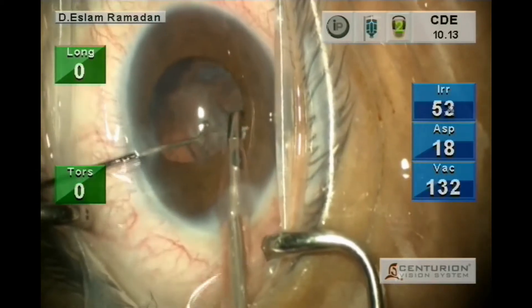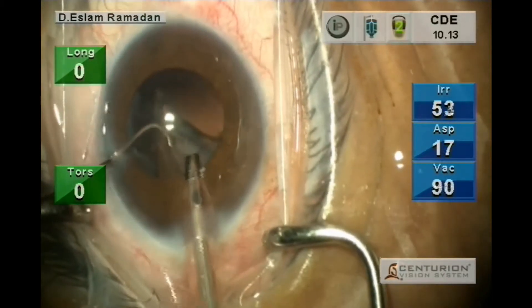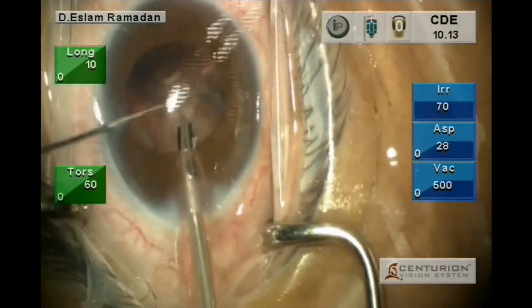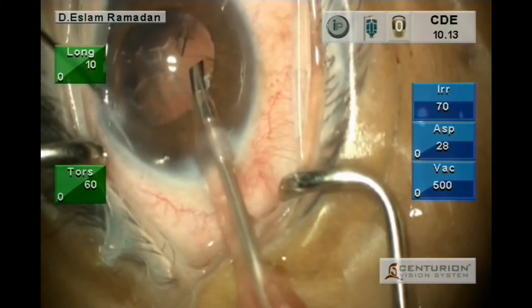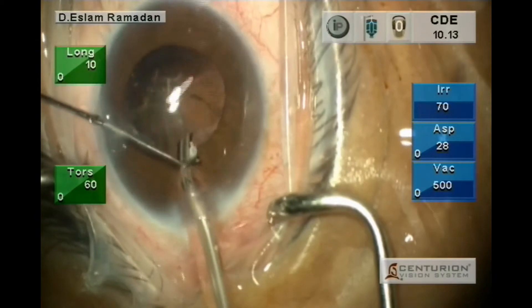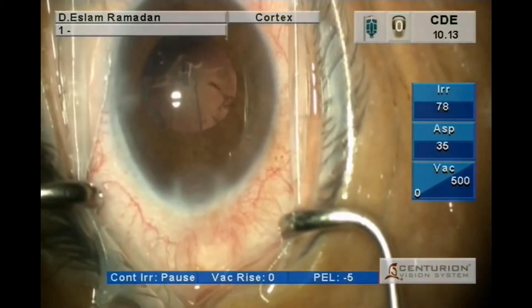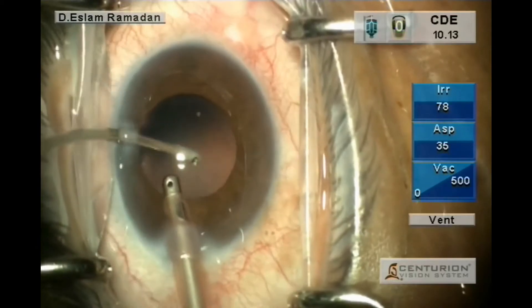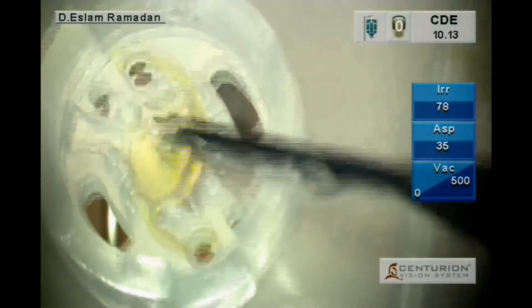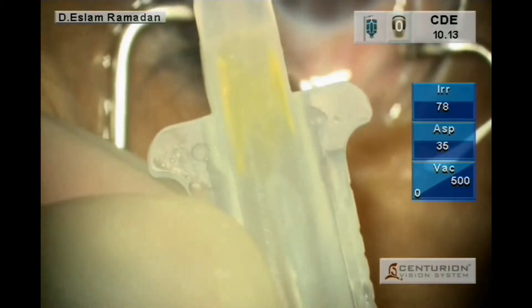Then doing the cortical removal. This is manual, assisting for removal of the cortex and even nucleus. Then using the bi-manual irrigation aspiration to clean the cortical material from the capsular bag. Then implantation of the intraocular lens — loading the lens into the cartridge and using the royal injector.